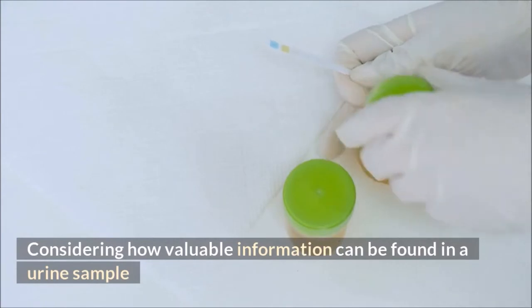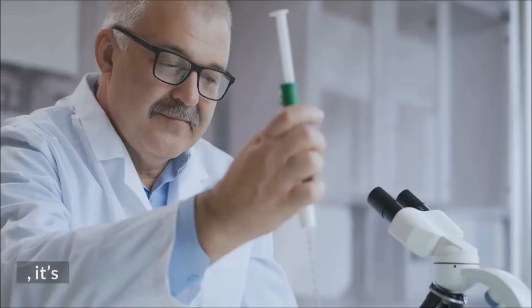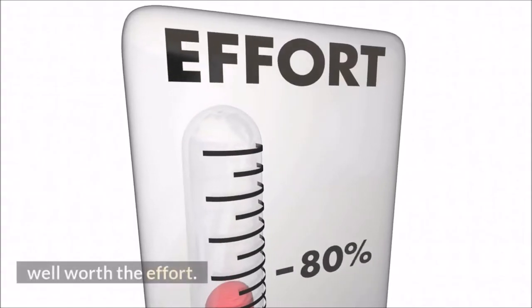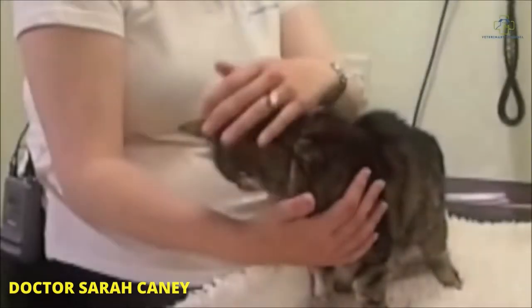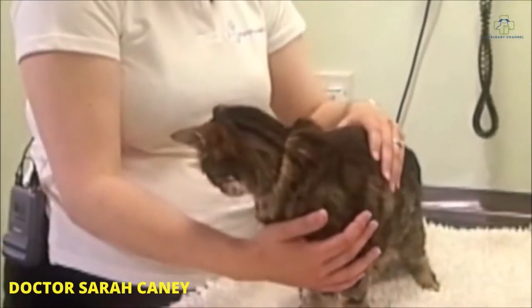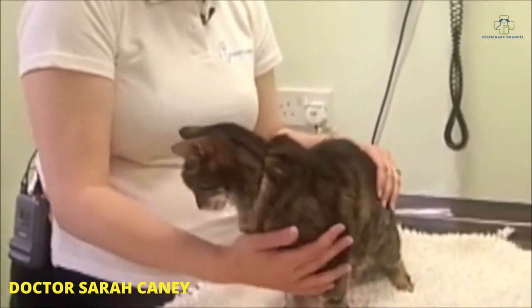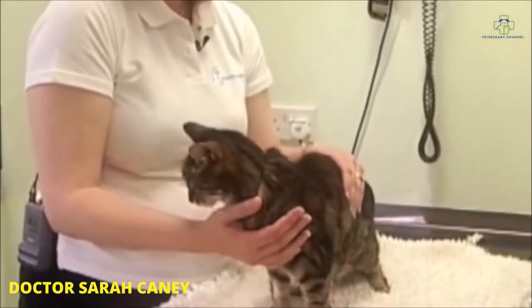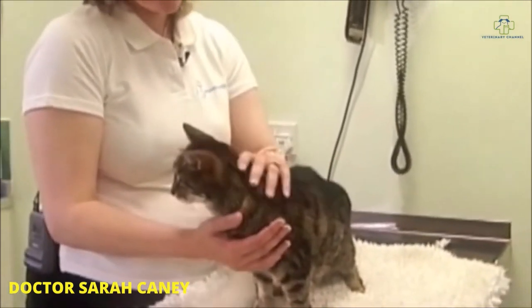Considering how valuable information can be found in a urine sample, it's well worth the effort. In general, the quickest and easiest way to get a urine sample from a cat is to do a procedure called cystocentesis.